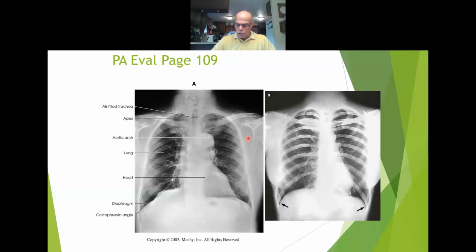Proper anterior shoulder rotation demonstrates the scapula projected outside of the lung field. Here we can definitely see that's the margin of it right there. You can actually almost see it going into what we call the scapula Y. Y'all remember that? There it is right there. Here's the thickest border. That thick border is on that outside edge. And here's your very thin border right there.